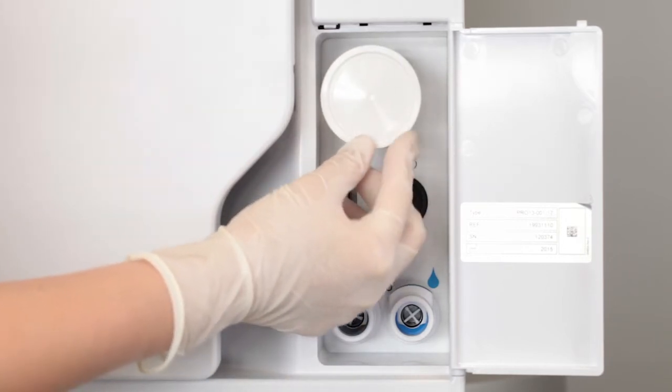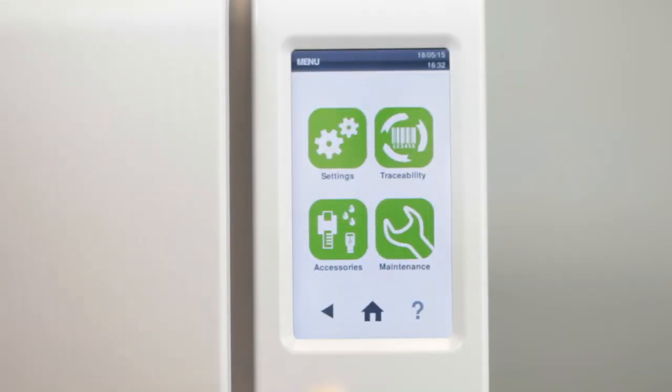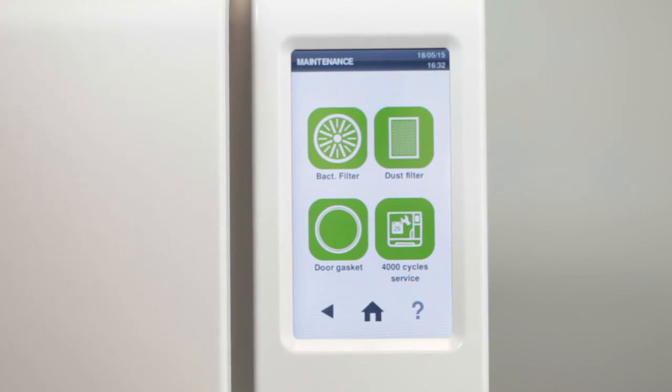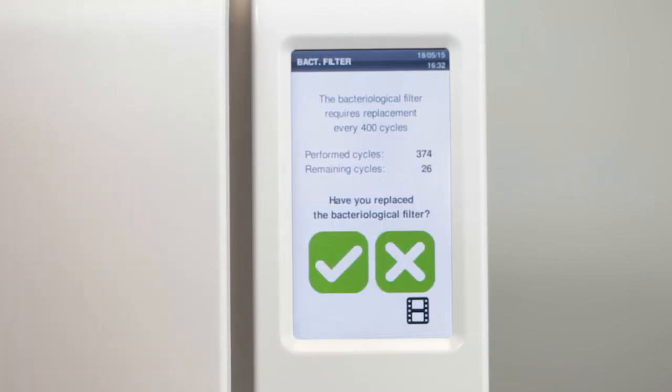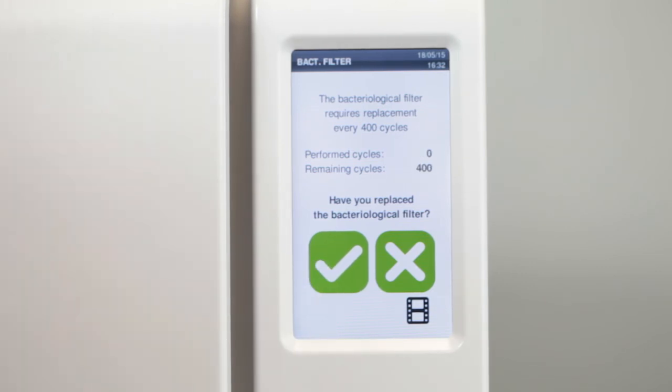After inserting a new filter, navigate to the maintenance menu option on the screen, where you can manually reset the counter for the bacteriological filter by confirming its replacement. Resetting the counter guarantees that you will be prompted to carry out maintenance again automatically after another 400 cycles.